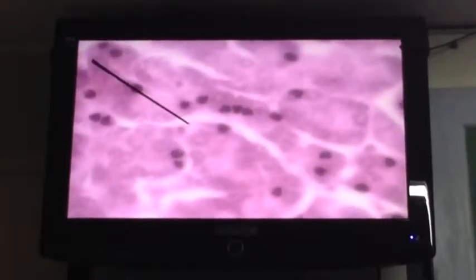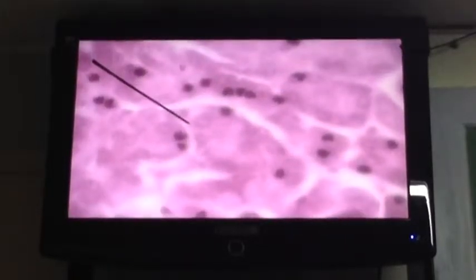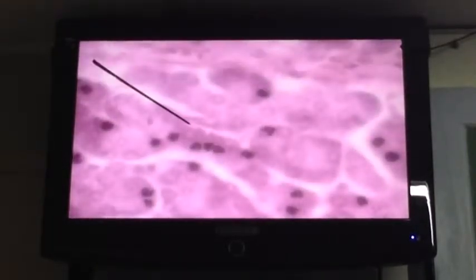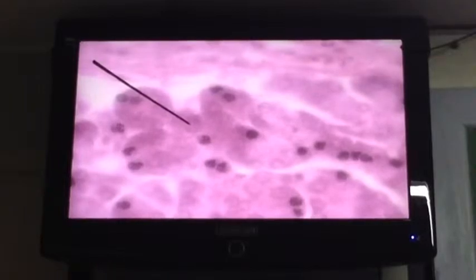Paano yung mag-differentiate ang ano sa yung ano yan? Yung stain? Alam niyo yung ilex ha? Sa example ng parotid.